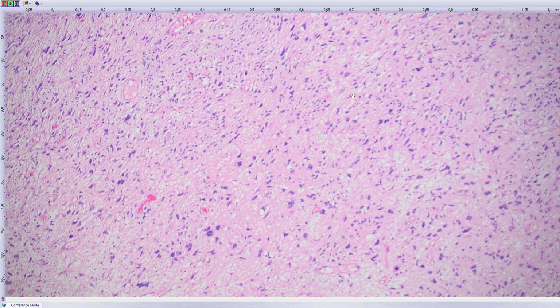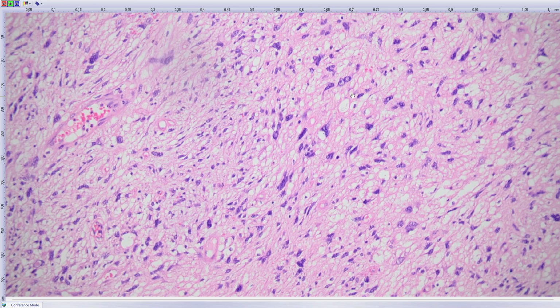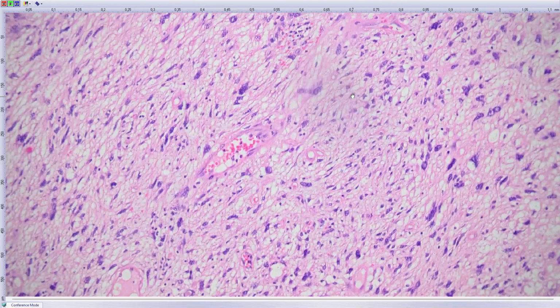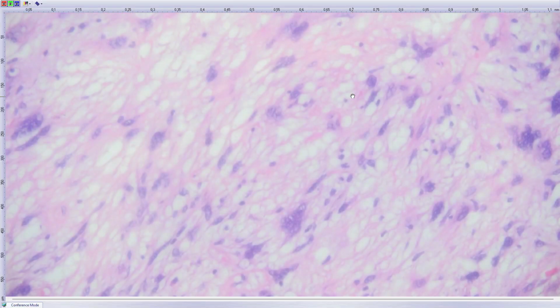Still we call it most probably benign proliferation, and sometimes in the literature there are described so-called angiomyofibromatous polyps, which are bizarre, and I think it's the same thing as here. I think that you can even see the lipoma-like differentiation in it, yeah? That means this is probably a huge atypical pleomorphic lipoma.